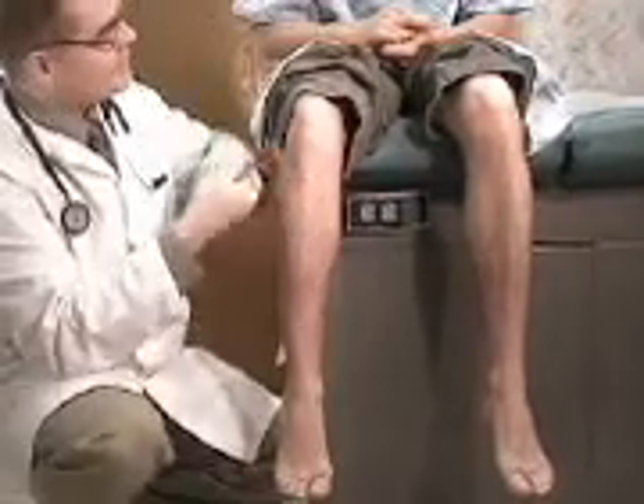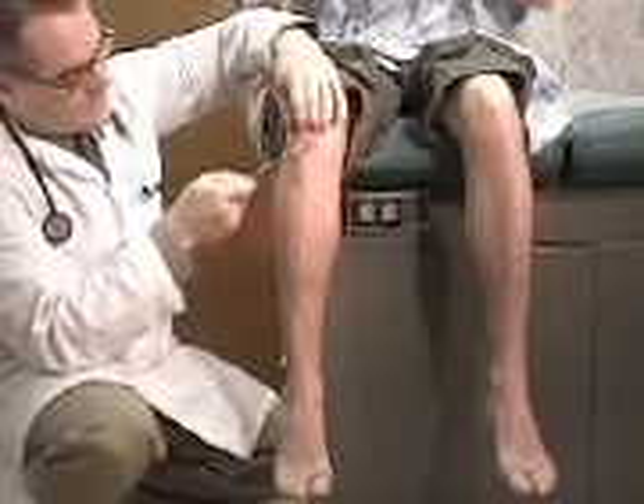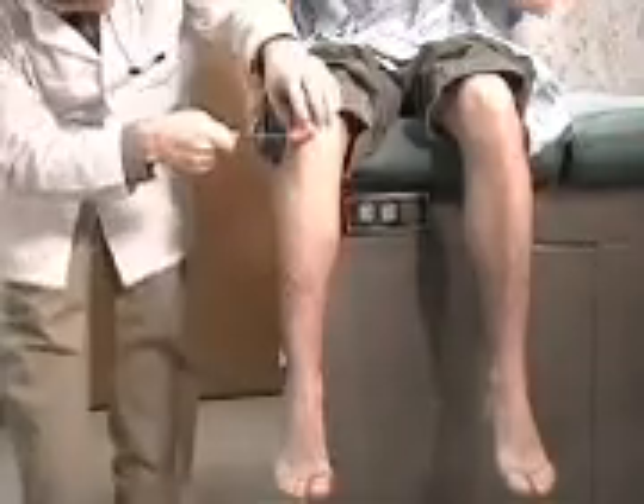The patient is asked to pull apart — Jason, if you could do that for me — which creates a distraction. The hammer is then localized to the patellar tendon, the patient is asked to relax, and the knee is struck. The result is compared to the other side. This is how we assess patellar reflexes.